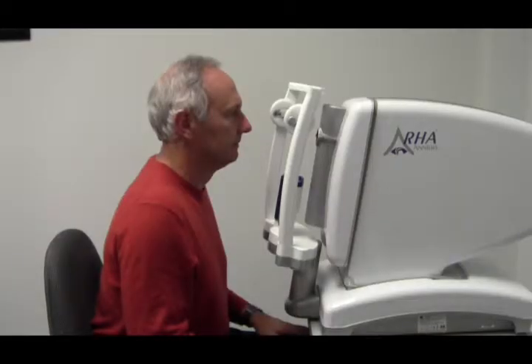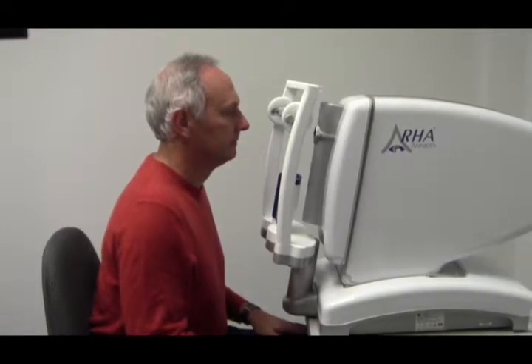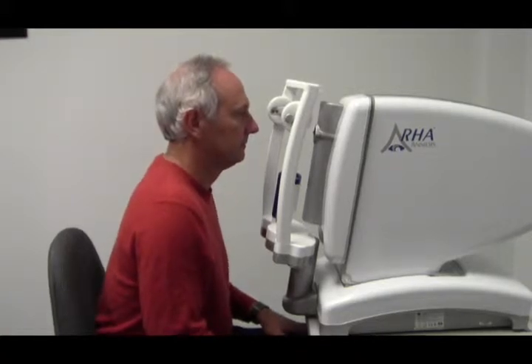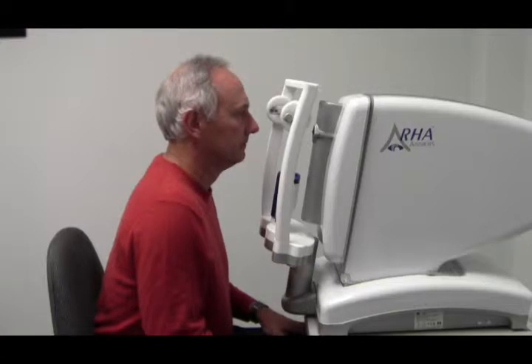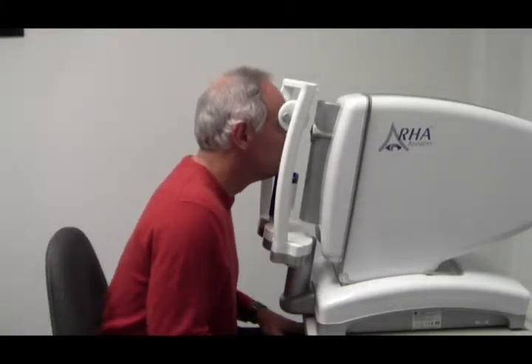Okay, so first we'll position the patient properly. We'll ask him to sit nice and straight, feet flat on the floor, and pull up nice and close to the instrument. We want to make sure that the table is at a proper height where the forehead strap is about eye level. Now we'll ask the patient to turn their head slightly to the left and put their chin in the chin rest, forehead right against the forehead strap.